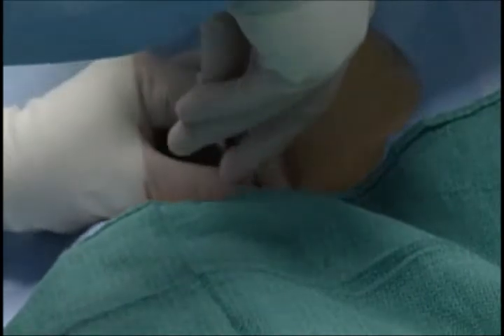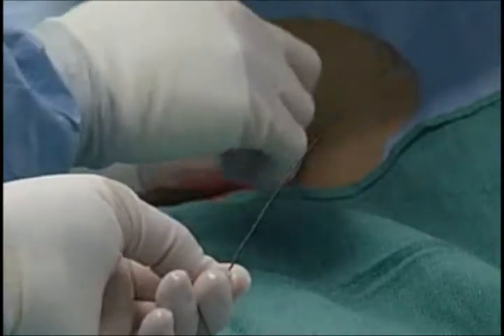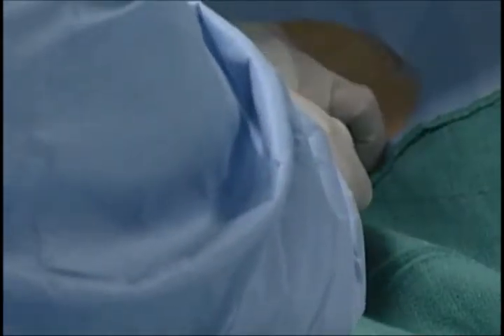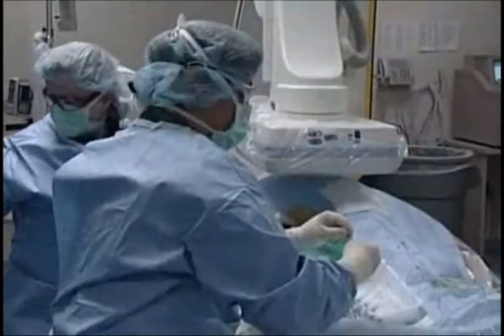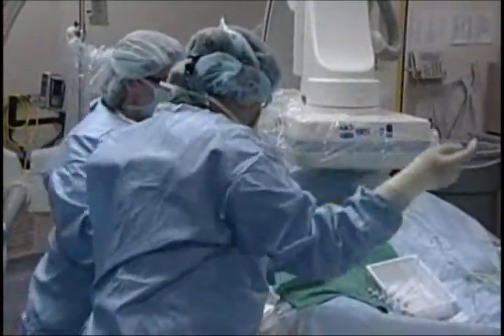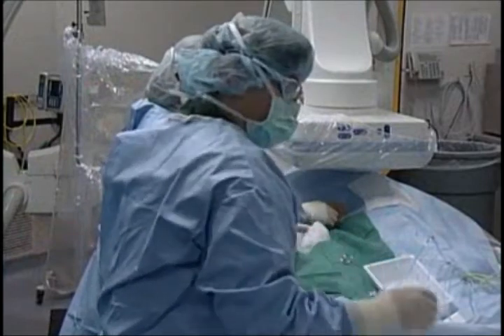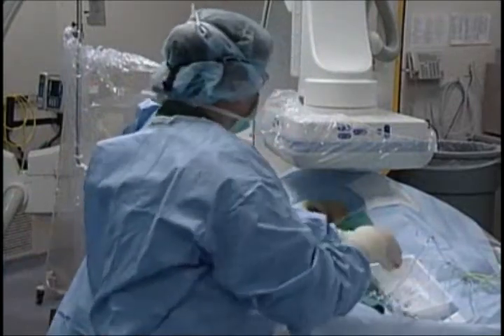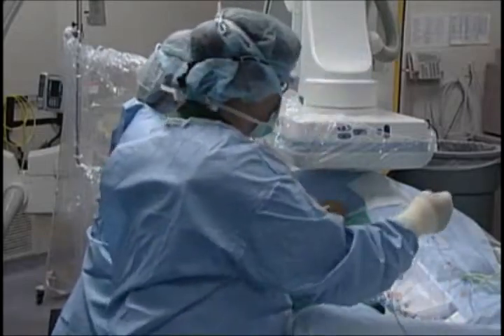These procedures are performed in the angiography suite in an OR-compatible room. They take about an hour and a half to two hours per case, depending on whether the anatomy has been defined previously or not. At this point the patient feels some pressure at the leg, but it's generally not particularly uncomfortable. They are relatively awake at this point because one of the first angiographic runs we need to do is imaging the portal vein — for that run, they need to hold their breath for about 12 seconds. Later, when we put in the chemotherapy, we tend to sedate people a little bit more, and they're usually dozing in and out through that part of the procedure.